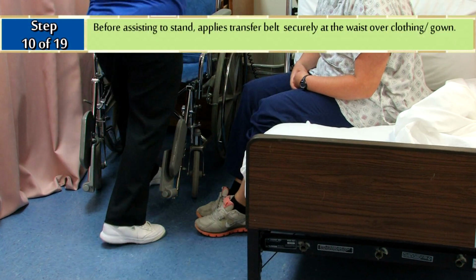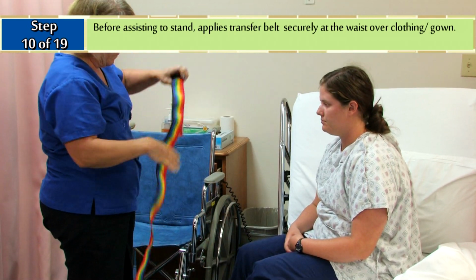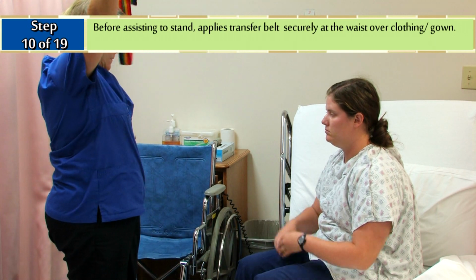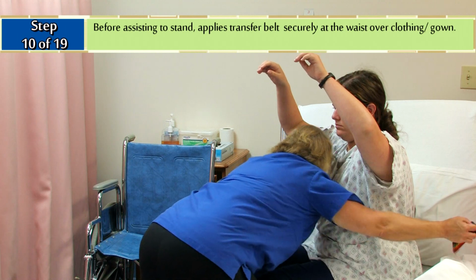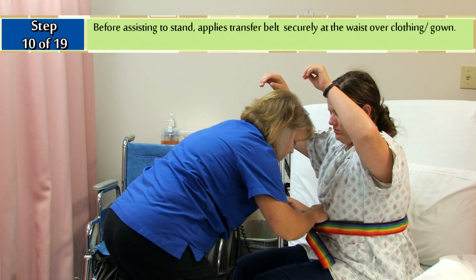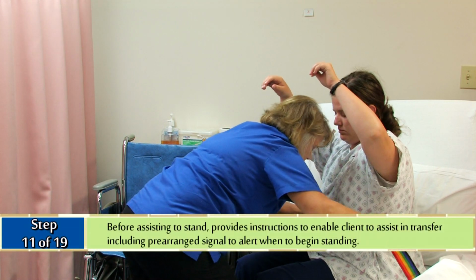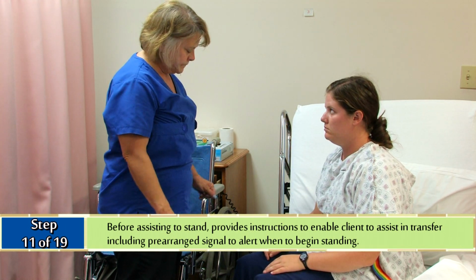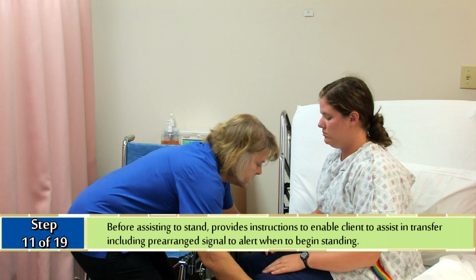Before assisting to stand, applies transfer belt securely at the waist over the gown or clothing. Before assisting to stand, provides instructions to enable the client to assist in transfer, including prearranged signal to alert client when to begin standing.